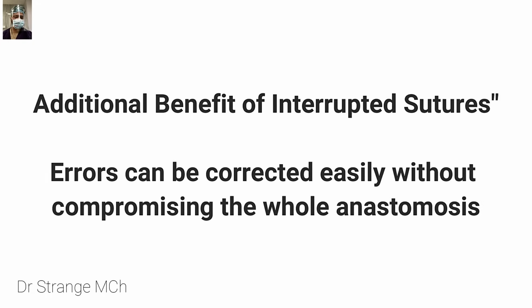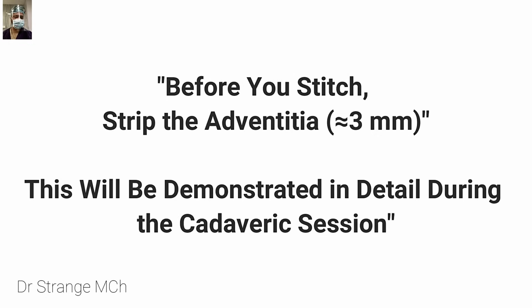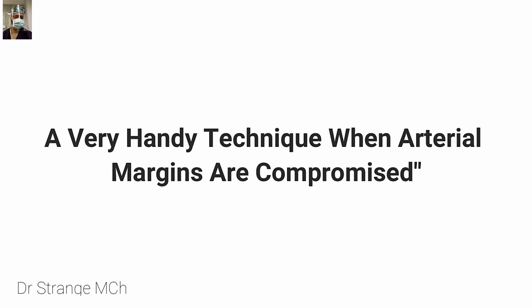Flush the artery with heparin before applying the last knot, and release the afferent clamp, then apply the last knot so that all the debris and clots are cleared. Unlike veins, arteries don't need a growth factor. I'm quickly rushing through as these points have already been covered. Strip the adventitia for 3 mm, and we will also demonstrate this during the cadaveric demonstration.